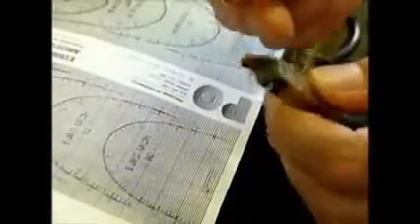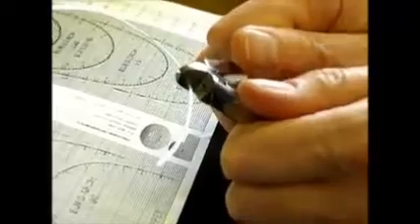So there are two ways of doing this, and I never know which people like to do. So one is to put the twist in the wire first, and try and make this at right angles, so that you go like that. Sorry, I didn't get the bit about right angle. This bit here needs to be at right angles to the wire. Okay. Because otherwise you can do it as an angle. You want to do it like that or like that. And then this one here goes in the opposite direction.